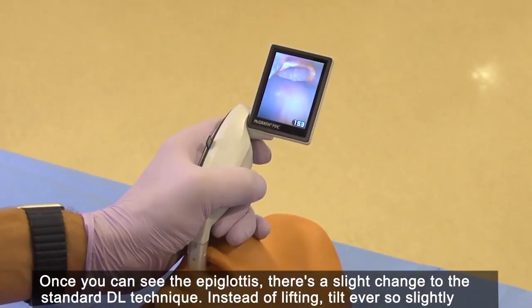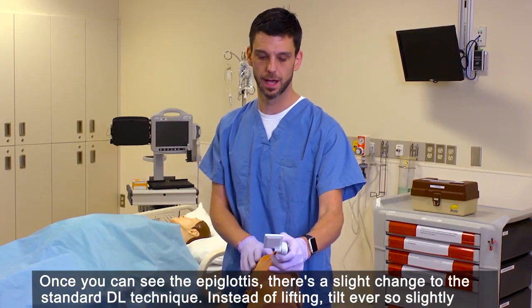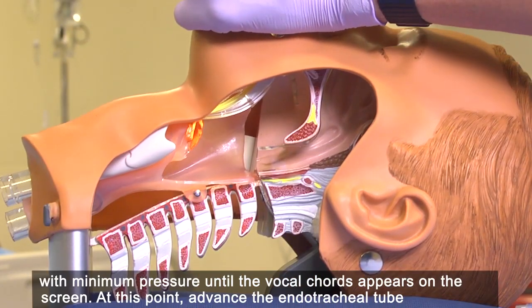Once you can see the epiglottis, there's a slight change to the standard DL technique. Instead of lifting, tilt ever so slightly with minimum pressure until the vocal cords appear on the screen.